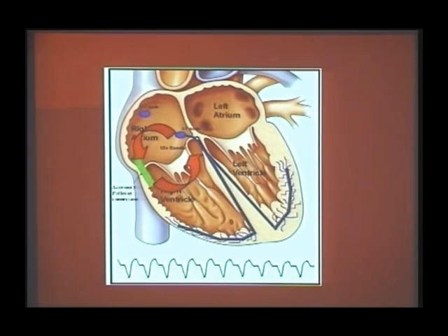This is the most dangerous tachycardia, because whatever impulse is produced by the atrium will just be transmitted to the ventricle. So the ventricle is not protected by the AV node. So this is where you have the sudden death. When the patient has atrial fibrillation, 400 per minute, 400 impulses to the ventricle, the ventricle will fibrillate and the patient will have a sudden death. So this is the wide QRS complex tachycardia.